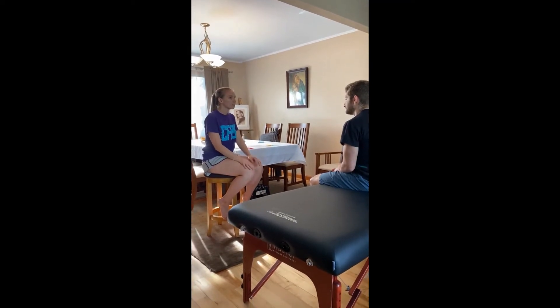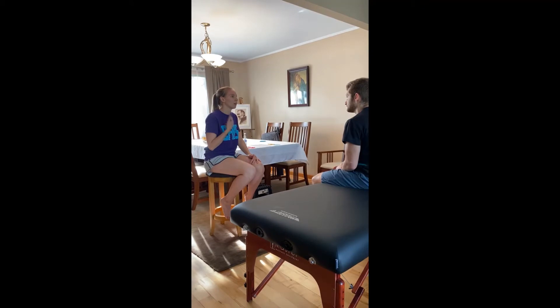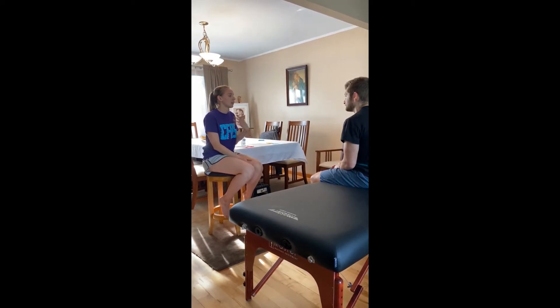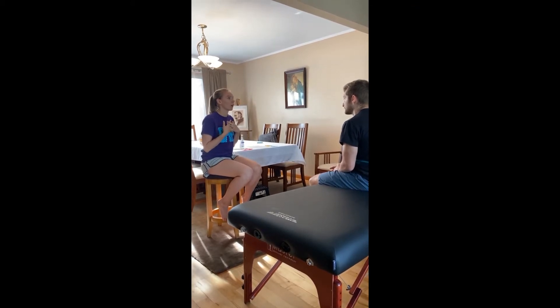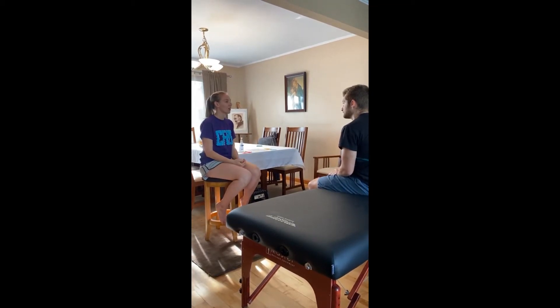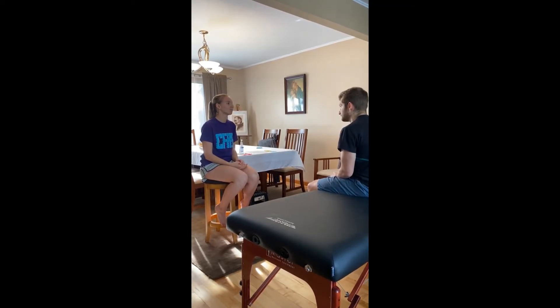Just to confirm — last session we did a sensation test with you at L2, L3, S1, S2 and everything was intact with fast pain, vibration, and light touch. We are good on that. I looked at your chart and you don't have any type of cardiac disease, pregnancy, or pacemaker, correct? And of course no impaired sensation because we did a sensation test. Do you have any other questions about the IFC? Can I just have you lay on your stomach? Do you want a pillow or anything for comfort?